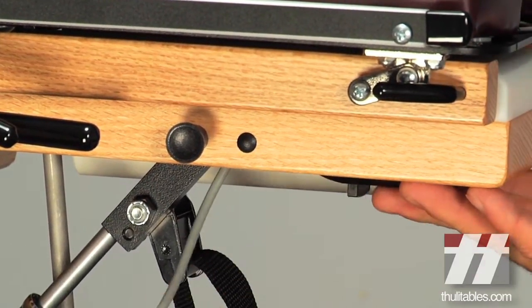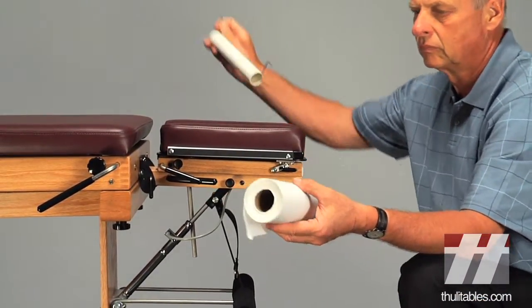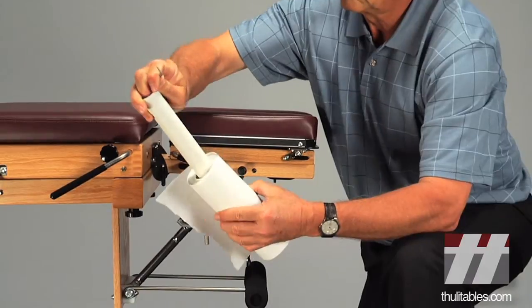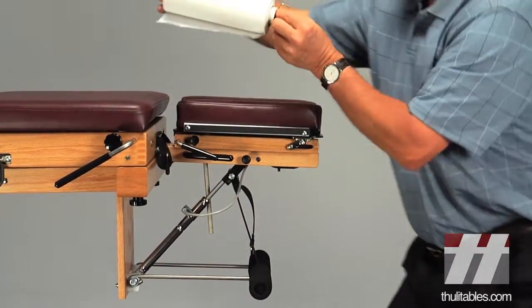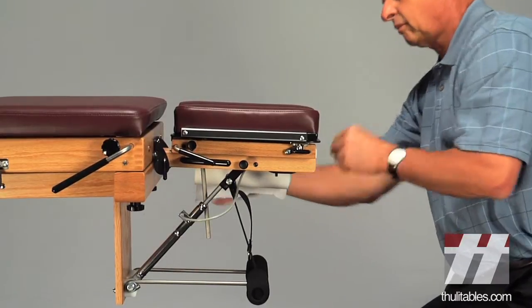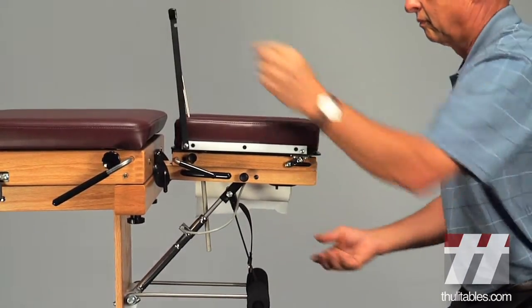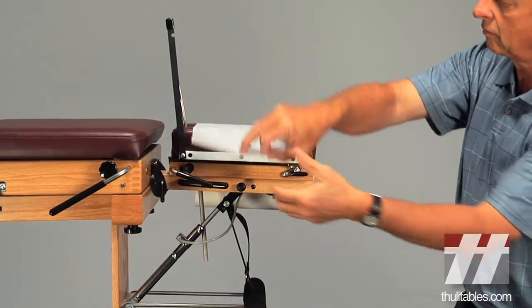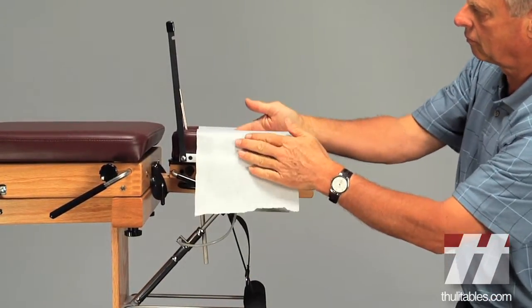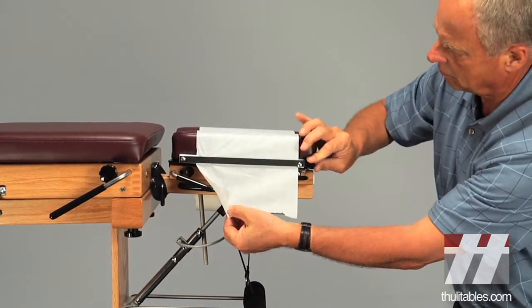Snap the remote cable into place. Slide the headpiece paper holder through the headpiece paper tube and install it with the orientation shown for ease of advancement. Lift the hold-on wire and the tear-off bar and unroll the paper. Tuck the paper between the cushions, lower the hold-on wire and tear-off bar, and remove the excess paper.